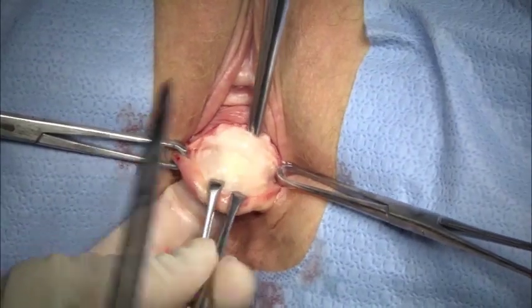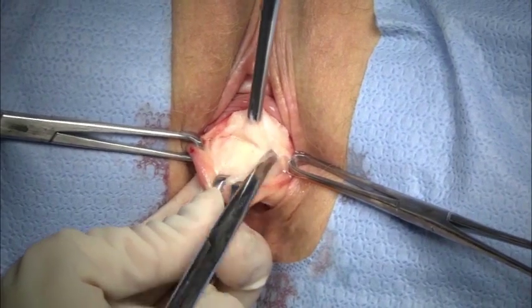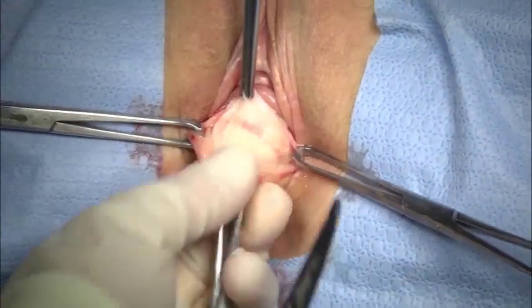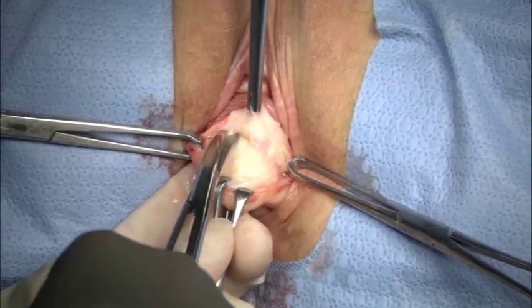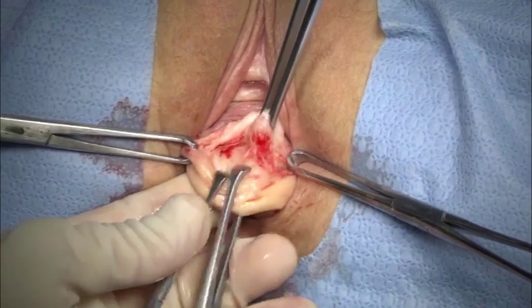Retraction of the bladder and upper skin edge allows for visual identification of the appropriate plane. Note my use of Alice clamps, marching sequentially up the repair, thereby tractioning on the defect and minimizing the need for deep retractors for internal surgery.